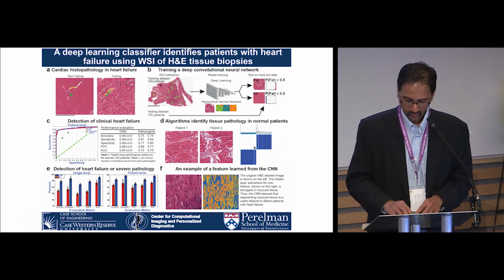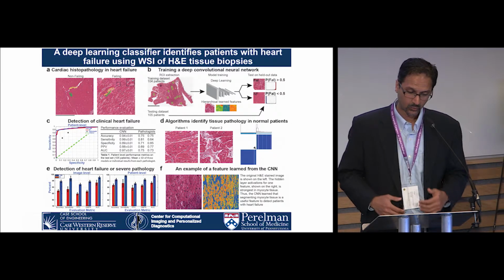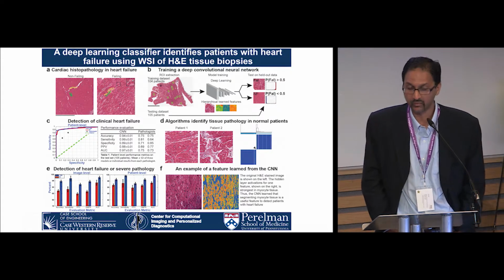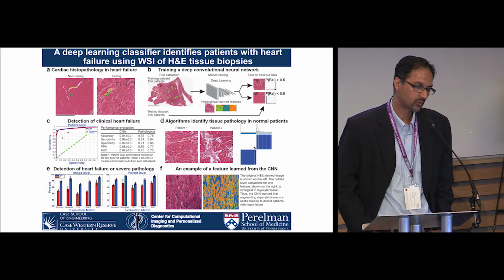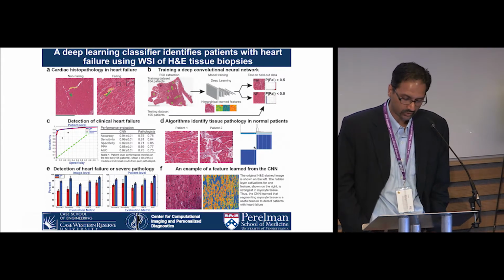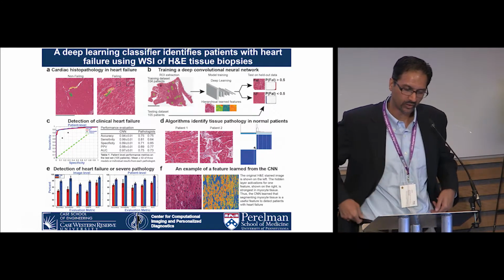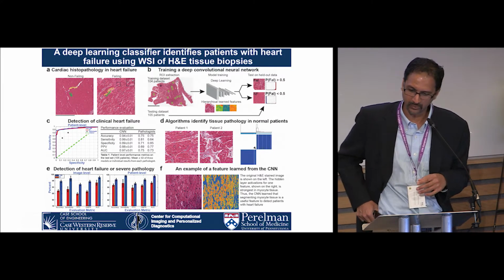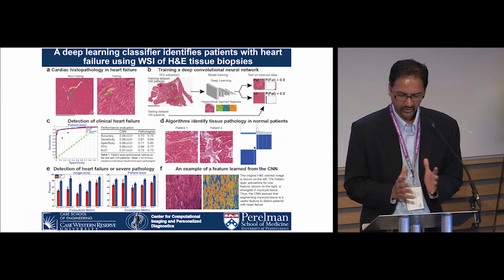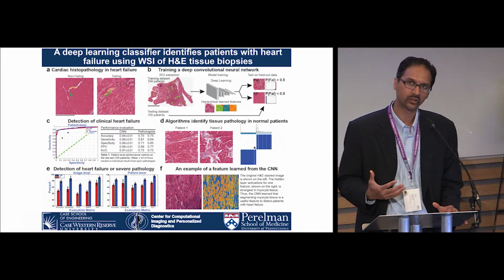But I will briefly talk about an experiment that we published last year. Again, this was work led by Andrew and Jeff Nerschel, who was at that time at the University of Pennsylvania. I was working with some of the folks in cardiology there. We had this idea: we've looked at deep learning to identify individual primitives, different types of cells, but could we use deep learning to address higher level questions, specifically patient level classification?